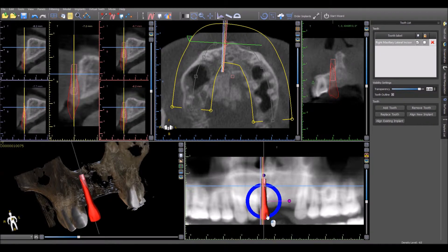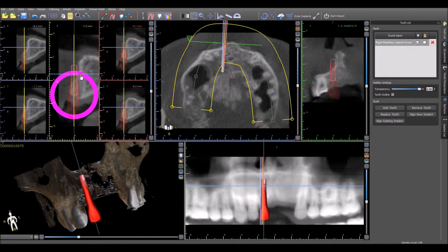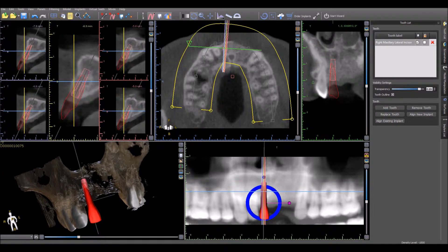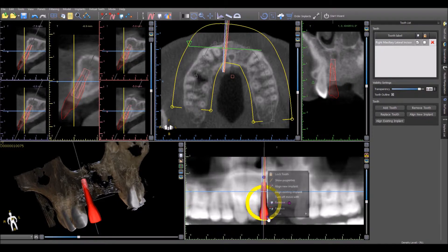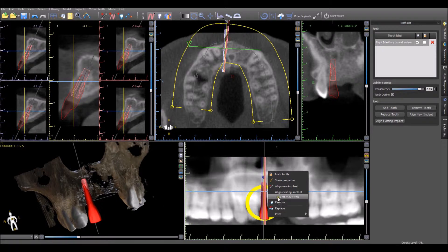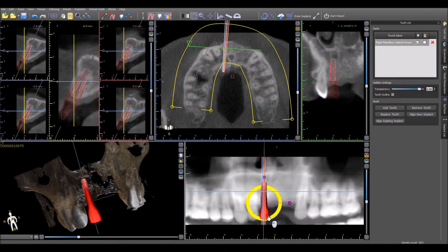The virtual tooth can be manipulated to the correct location in any of the views. To disconnect the implant from the virtual tooth to allow each one to be moved separately, simply right click on the virtual tooth and select Turn Off Move With. This will turn off the Move With functionality and each element can now be moved independently.